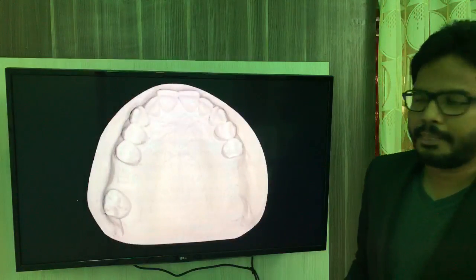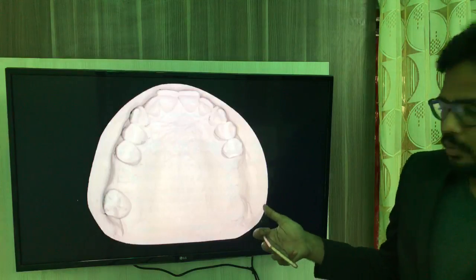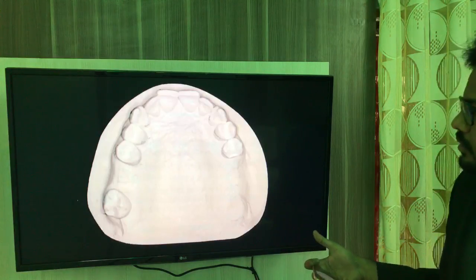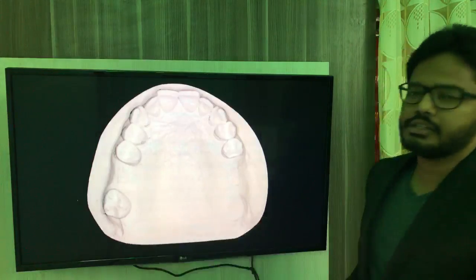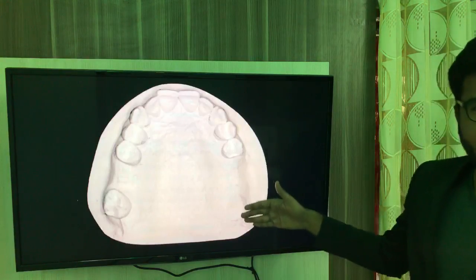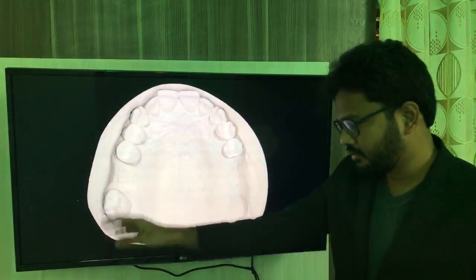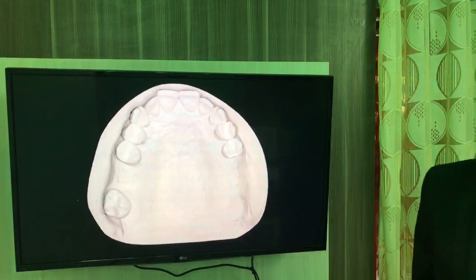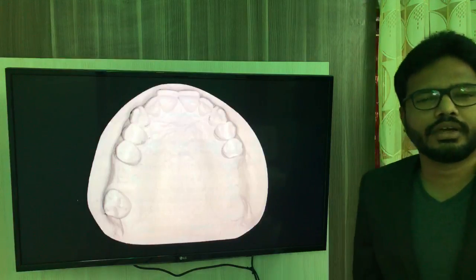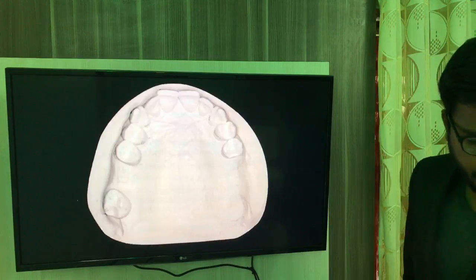And what about this? You can see it's an upper cast, with a unilateral posterior edentulous area and an additional edentulous space on the first quadrant. Obviously the posterior most edentulous space decides the classification compared to the first quadrant. So it's class 2 modification 1, right?